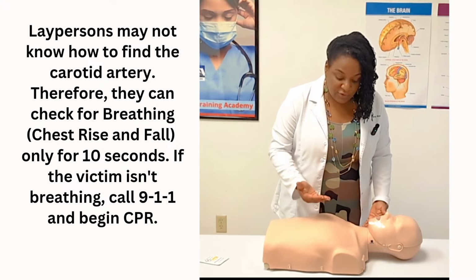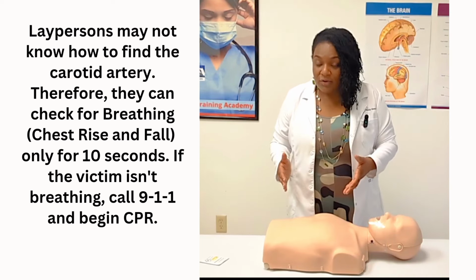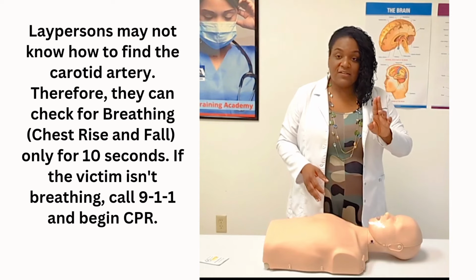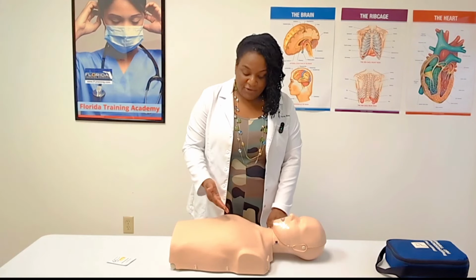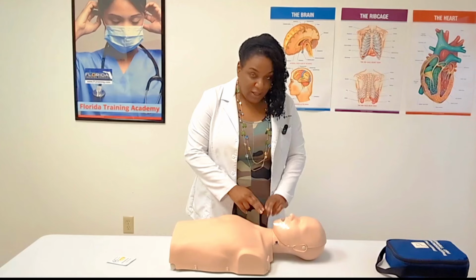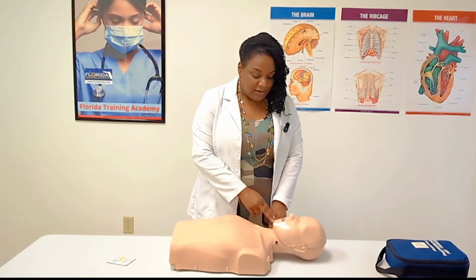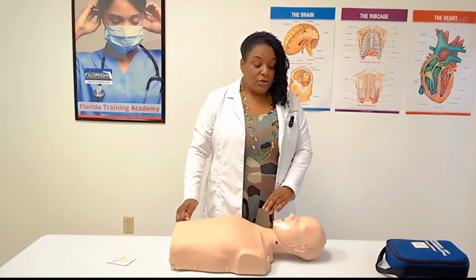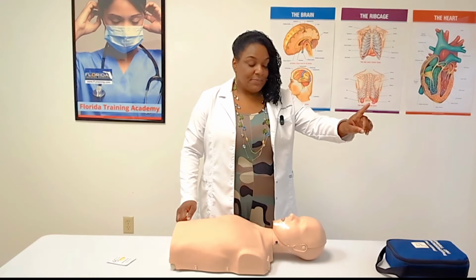So I'm going to be watching for chest rise and fall for 10 seconds. If I'm a lay person, I don't have to feel for a pulse, but if you're a nurse, a doctor, a CNA, someone who's been professionally trained, you're going to feel for a pulse and check for breathing simultaneously, no longer than 10 seconds. So I have my 2 fingers on a carotid artery. It's in the neck area on the side nearest me. I'm also watching the chest rise and fall. 10 seconds. No pulse, no breathing. Hey, you also bring me the AED.